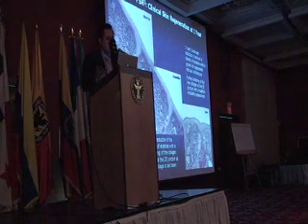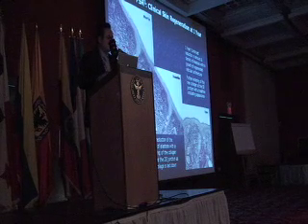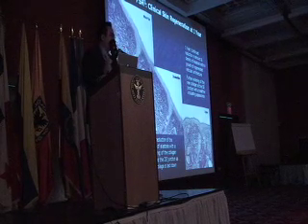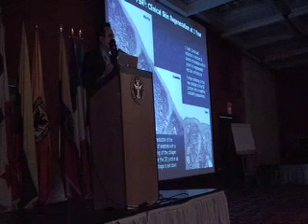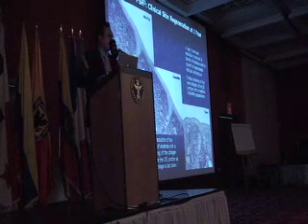These are just some histologic changes, and the point of this slide is not for you to memorize every little histologic architecture, but to understand that the evolution of improvement requires a full year. And during your pre-consultation with a patient, you must convey that information effectively. They will otherwise come back to you at a month and go, how come I wasted my money?